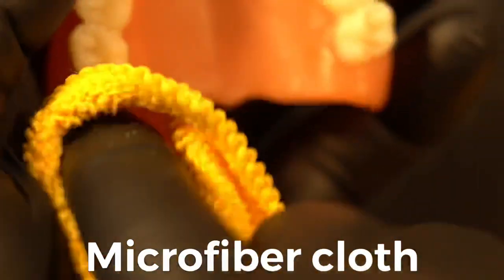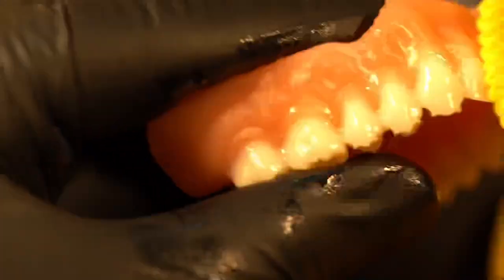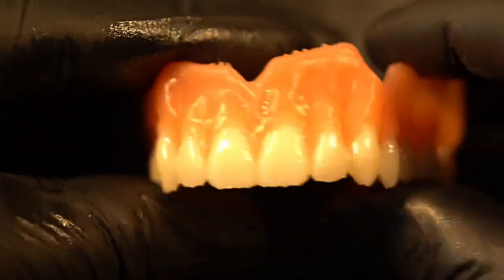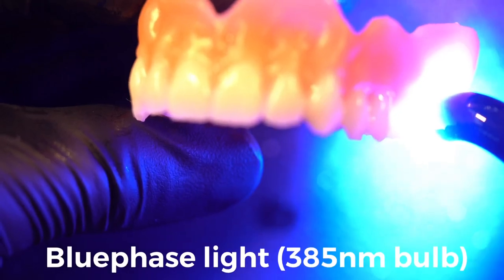Taking a microfiber cloth here, spreading that excess material down over the teeth, and that's going to create this really cool high shine — this is like a little clear coat. This is not the time to be super careful and get every little ounce of material off, because that material is actually working in your favor.